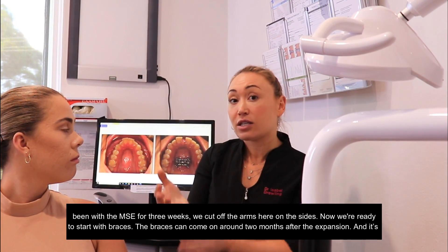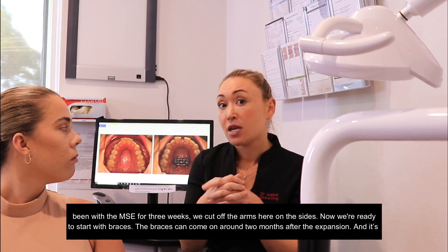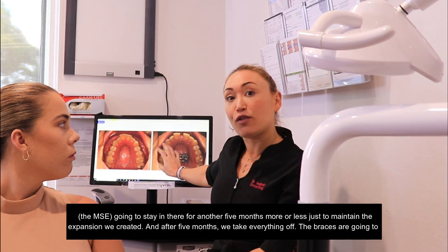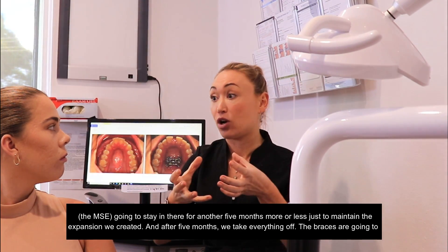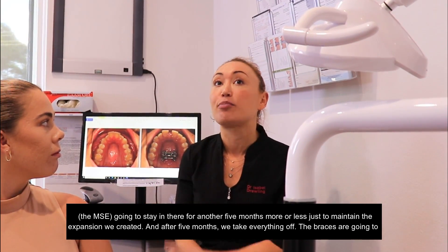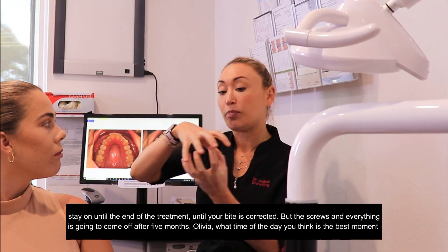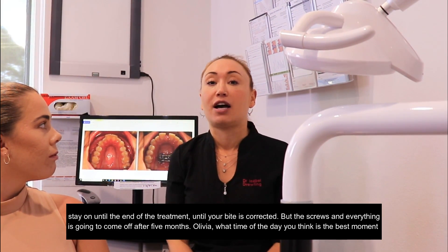The braces can come on around two months after the expansion, and the MSE is going to stay in there for another five months more or less, just to maintain the expansion we got. After five months we take everything off. The braces will stay on until the end of treatment, until your bite is corrected, but the screws and everything come off after five months.